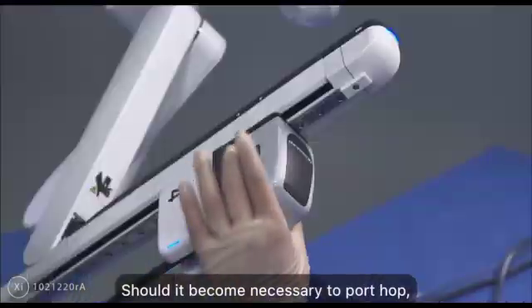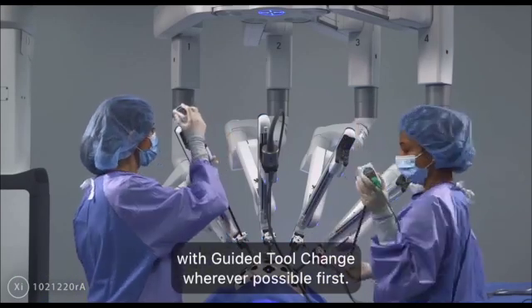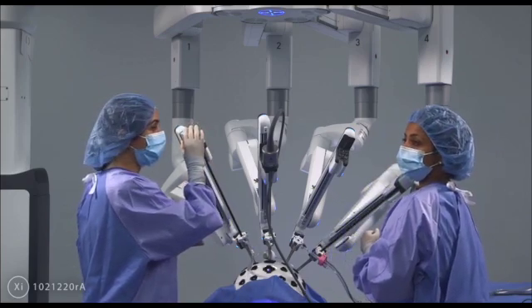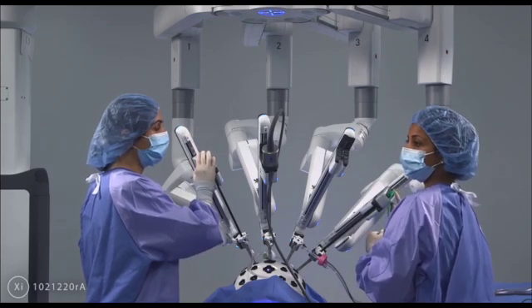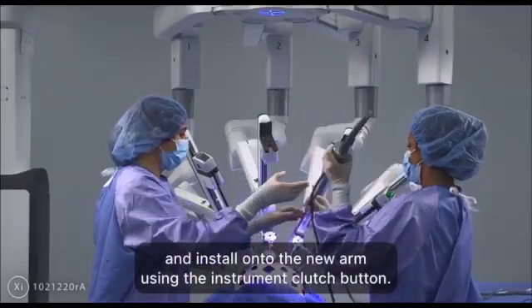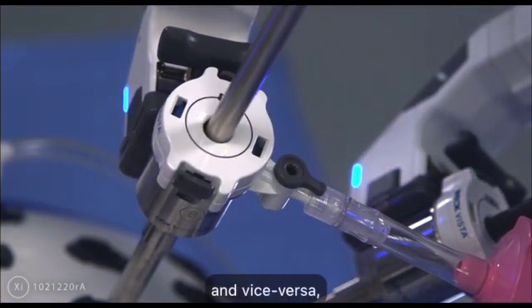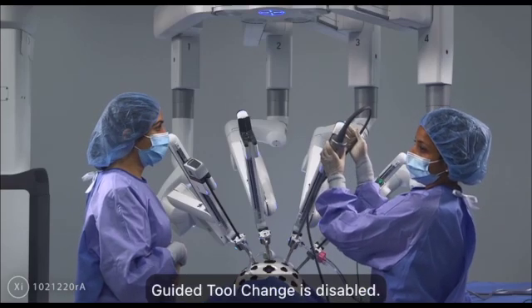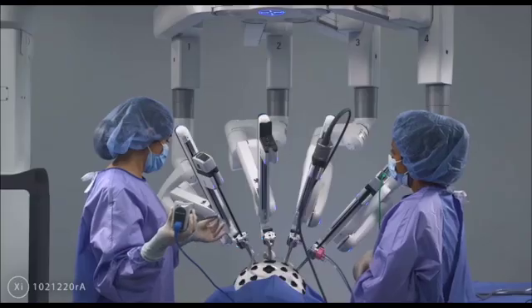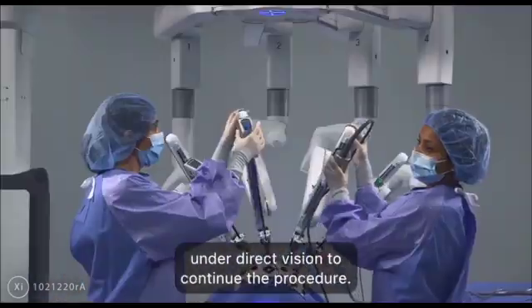Should it become necessary to port hop, sterile staff will exchange instruments with guided tool change wherever possible first. Then he or she will remove the endoscope and install it onto the new arm using the instrument clutch button. Please note that when exchanging an instrument for an endoscope and vice versa, guided tool change is disabled. Finally, he or she will install the remaining instruments under direct vision to continue the procedure.